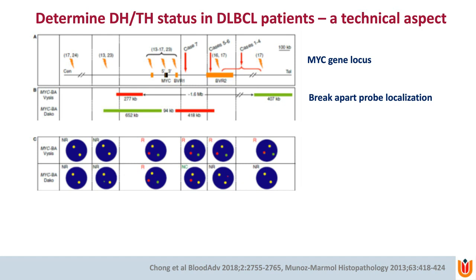However, when the break falls within one of the probes, and when the probes are not so super localized, such as in the lower panel, and fall, for instance, at the right, within the right probe, you see at the bottom panel only a single red signal that is separated off, while the other half of the probe, let's say, gets associated with the green probe still and gives another yellow signal.